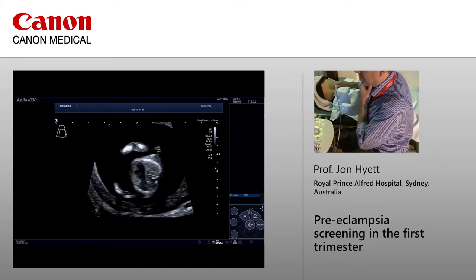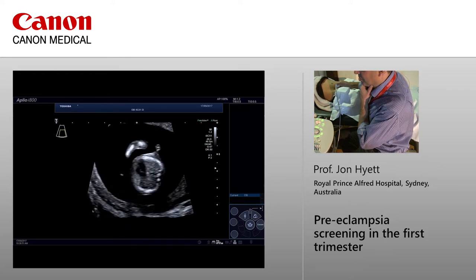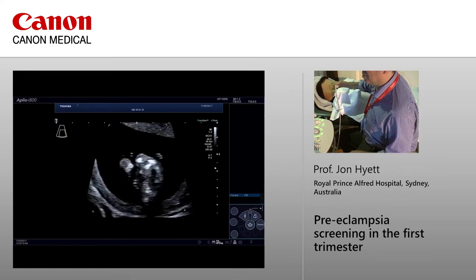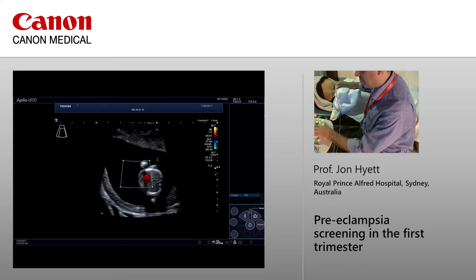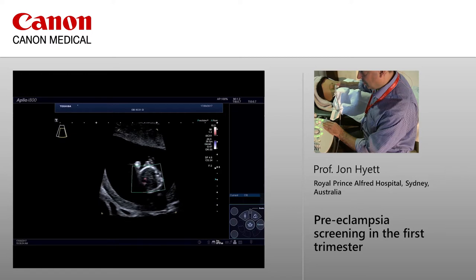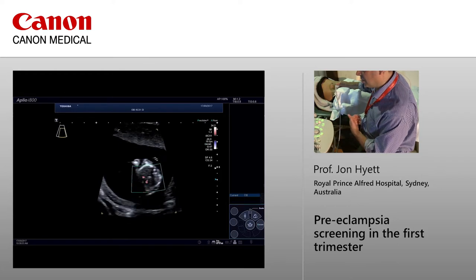So I'm a bit of an opportunist when I'm scanning in the first trimester, and if you've got the fetus in a nice position to be able to look at various structures, it's good to do that. You can also see the baby's moving quite a lot. So often I find it's better just to sit in one place and let the fetus do the work. And you can see the chambers, both ventricles fit in quite nicely. Occasionally as the fetus rotates, you get that view of the left ventricular outflow tract, and then the right ventricular outflow tract and the vessels coming up to the head and neck. So I think that all looks quite nice.